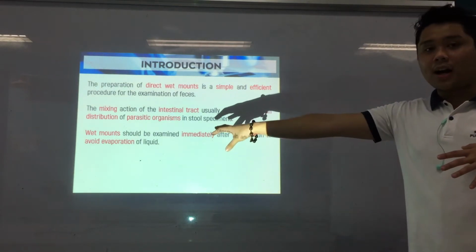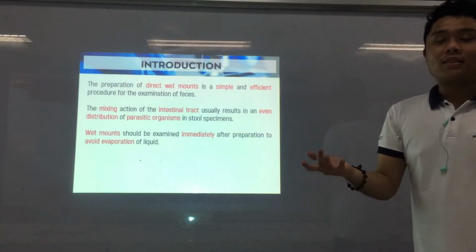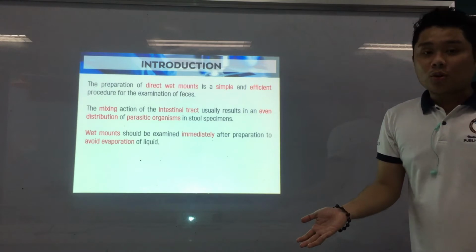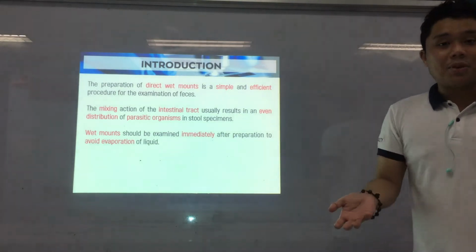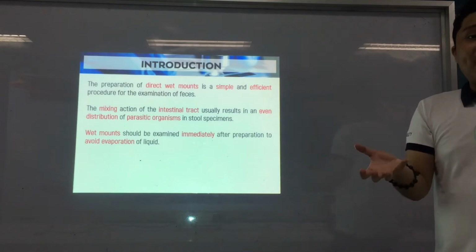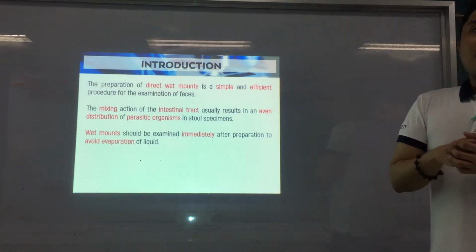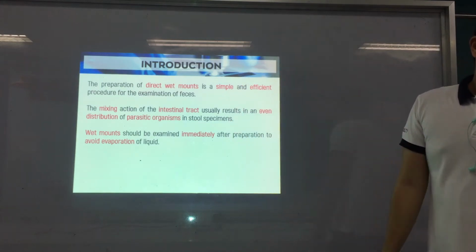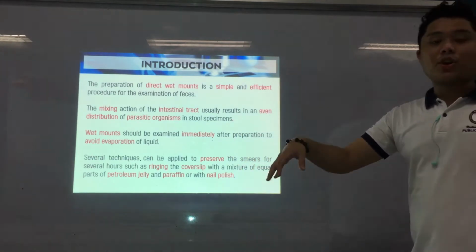Why? Because the liquid, the reagent that you use, can evaporate. Once the liquid has evaporated, your examination will not be satisfactory anymore, or it would not be of diagnostic value. It would not help you anymore because the stool itself cannot be visualized, because there's no liquid anymore that suspends the stool, which makes the examination much easier. So that's for the wet mounts. Again, examine immediately.